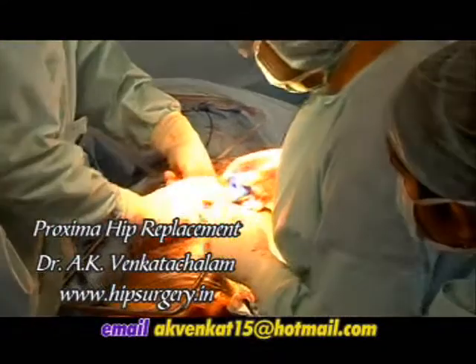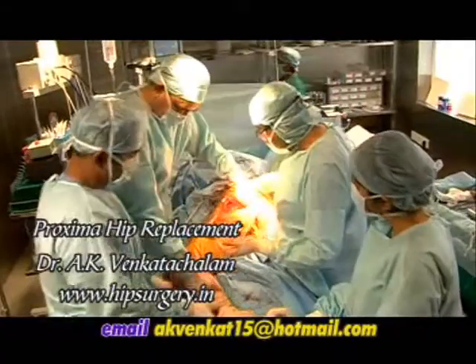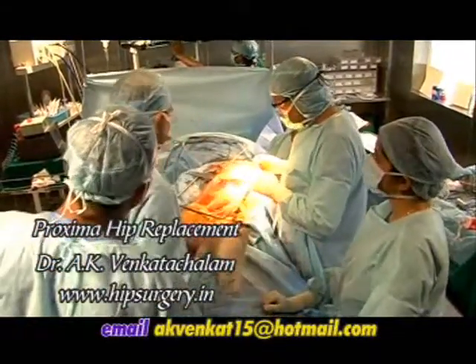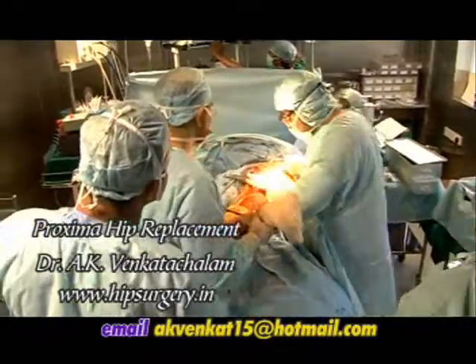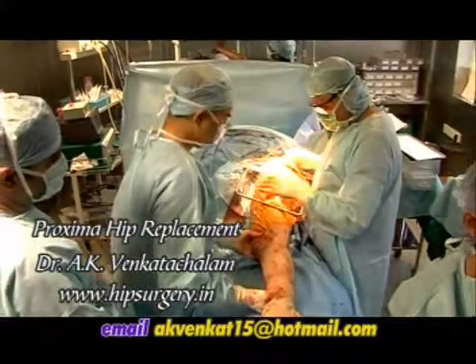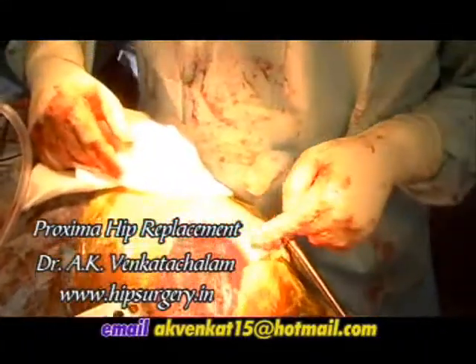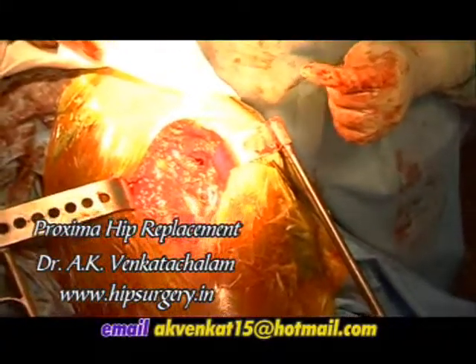The correct neck length and head diameter are chosen and assembled onto the prosthesis. The femur is now once again checked through a full range of movement in flexion and rotation and is found to be stable. The trial prosthesis is in and now we are going to obtain X-ray verification of the position.